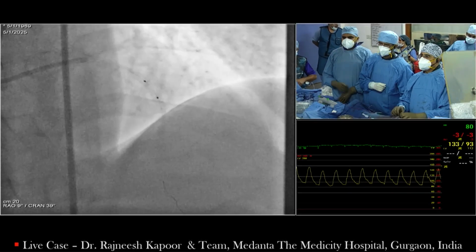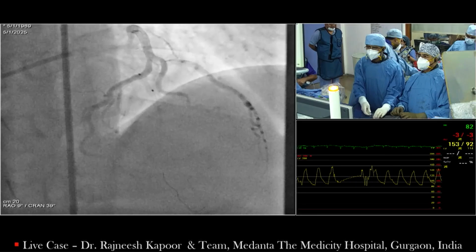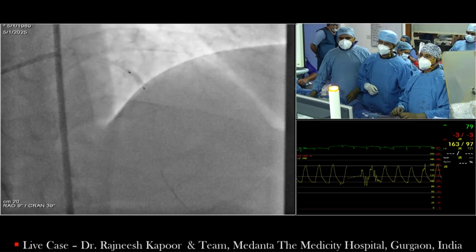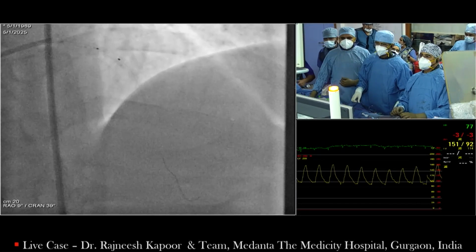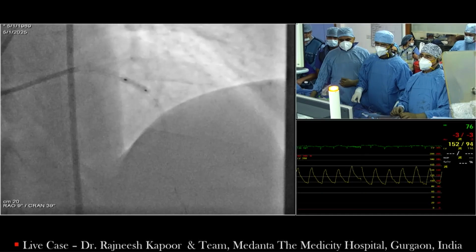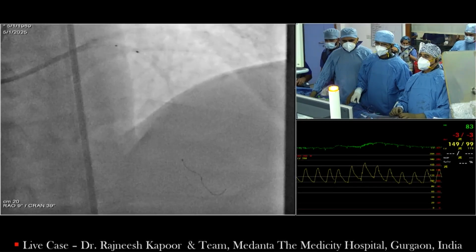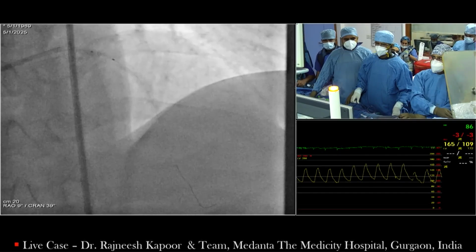This is 2.5. Go up, 6, 8, 10, 12, 14, 16. Down. Again go up. Are you going to proximally dilate with a bigger balloon or only 2.5? No, we plan to actually dilate with a 2.75 or 3 balloon. Go up again, 16, 18. Down.